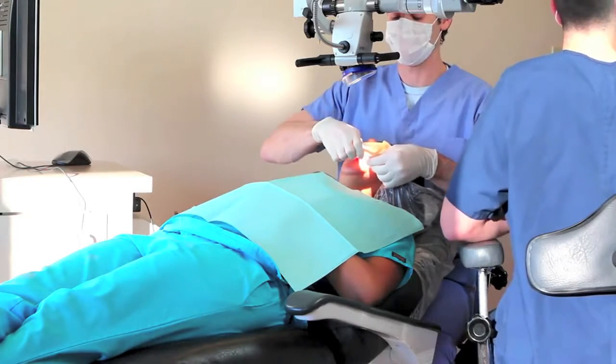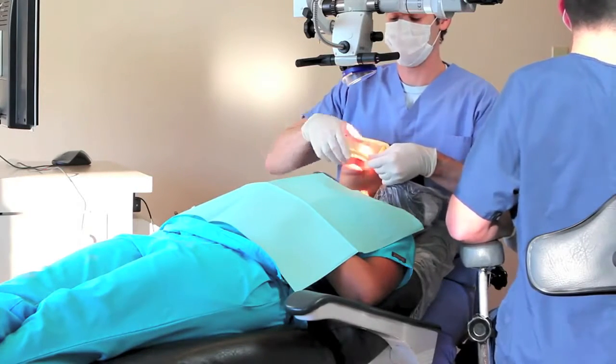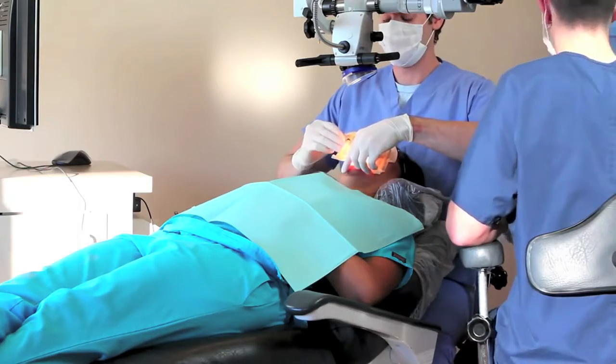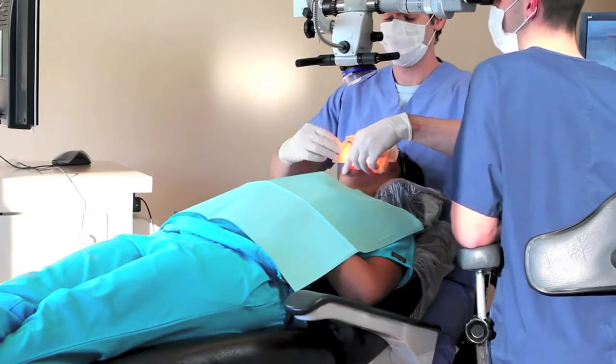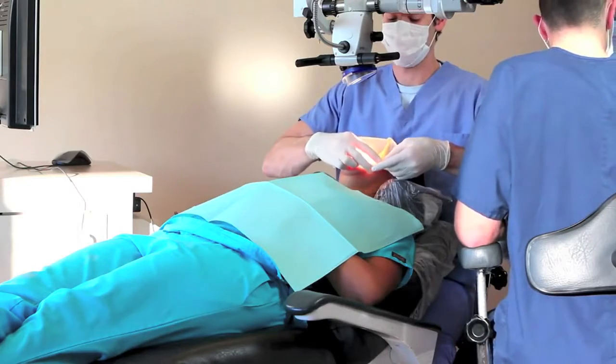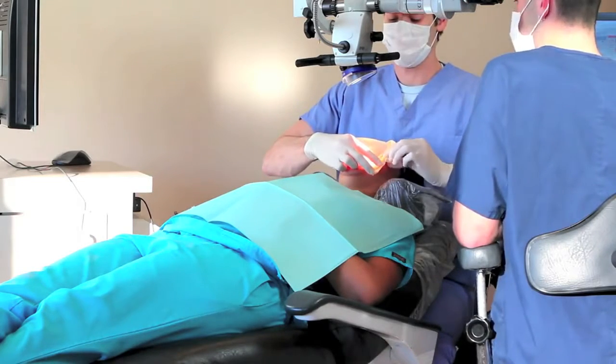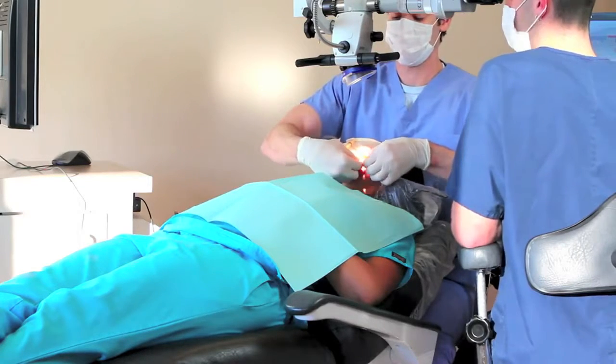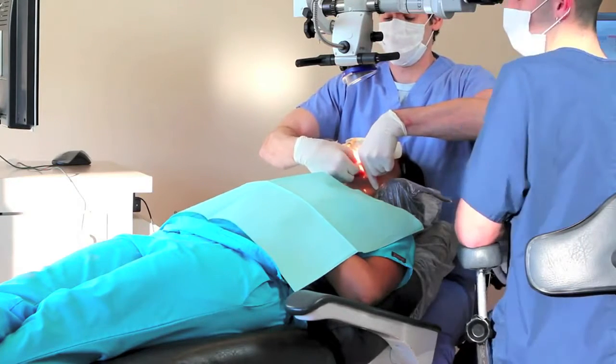Once you slide that rubber dam frame on, it's going to flip over the patient's nose. They're going to feel very claustrophobic. Do not cover their nose with that rubber dam. Take a couple of seconds, take scissors, and cut right around where their nose is so they can continue to breathe. If a patient has trouble breathing through their nose, make a small opening on the contralateral side of the tooth you're working on so they can breathe through their mouth.